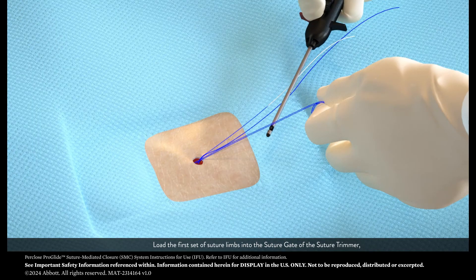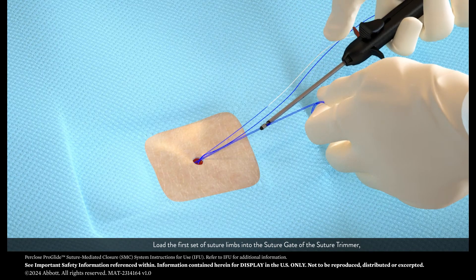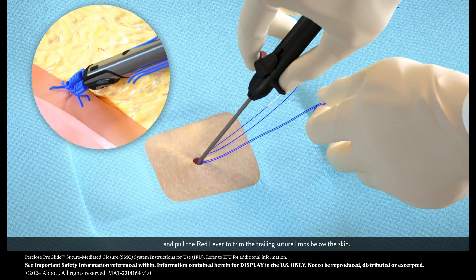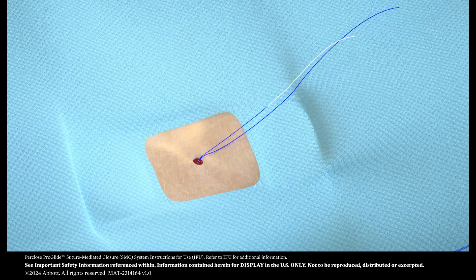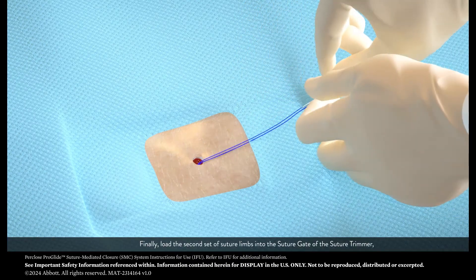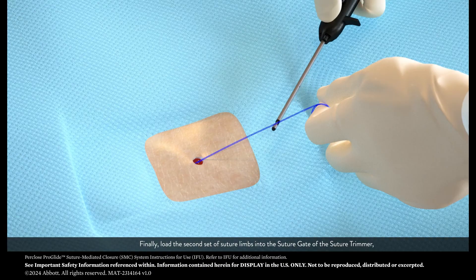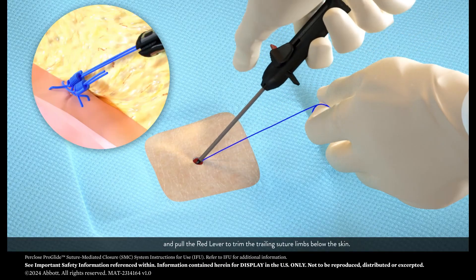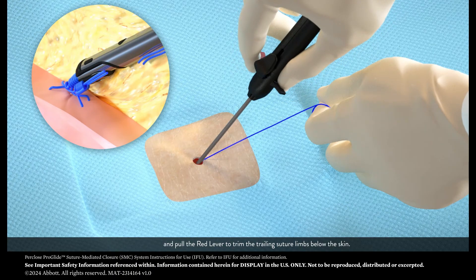Load the first set of suture limbs into the suture gate of the suture trimmer. Pull the red lever to trim the trailing suture limbs below the skin. Finally, load the second set of suture limbs into the suture gate of the suture trimmer and pull the red lever to trim the trailing suture limbs below the skin.